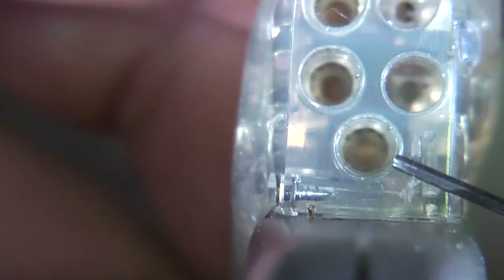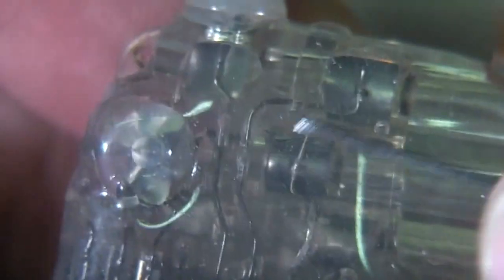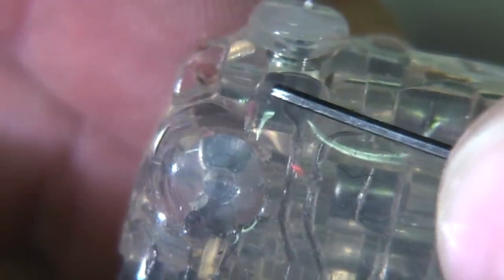These three connections on the right are just single pole, but it looks like these left-hand ones are for coax. There's an outer sleeve and then an inner electrode here, so there's probably a shielded connection or just a two-pole connection on some sort of coaxial cable. And this top block seems to be pinned on.